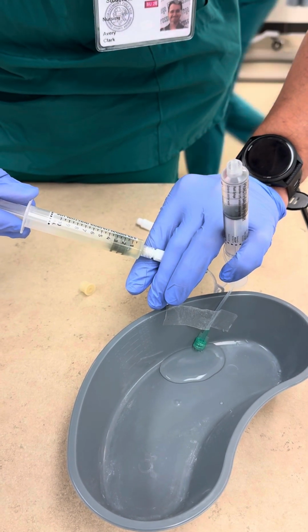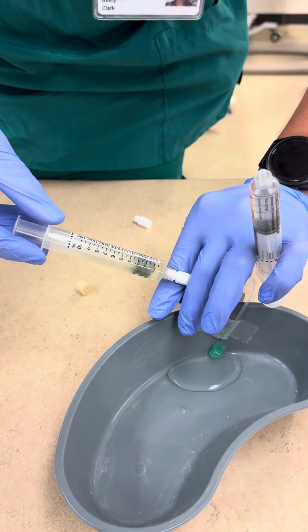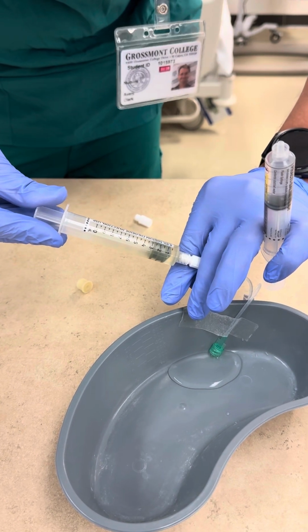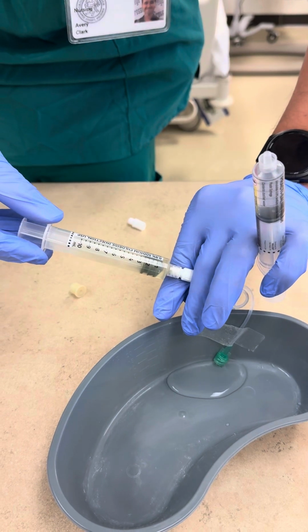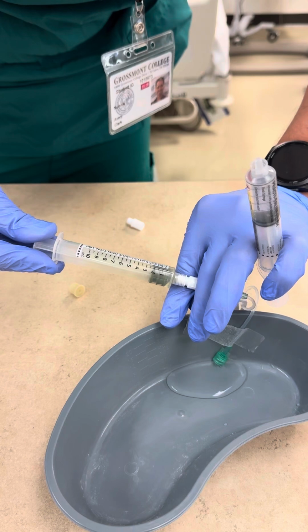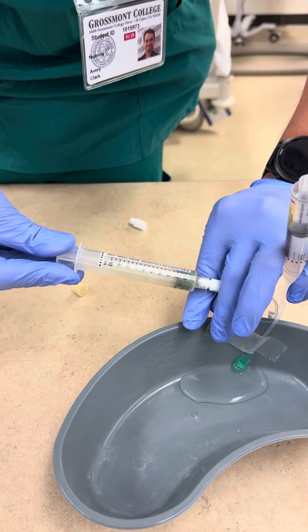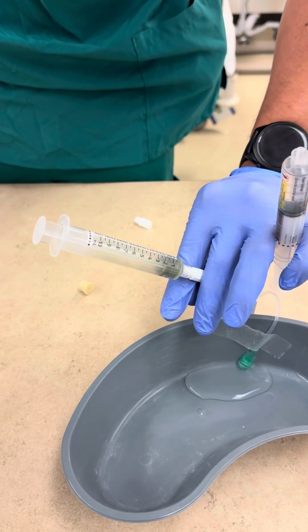nice and slowly. Good. I'm going to wait 30 seconds. I'm going to administer another 0.5 milliliters. I'm going to wait 30 seconds. I'm going to administer another 0.5 milliliters. I'm going to wait 30 seconds. And I'm going to administer the last 0.5 milliliters. All done. And I'm going to wait another 30 seconds at this time.